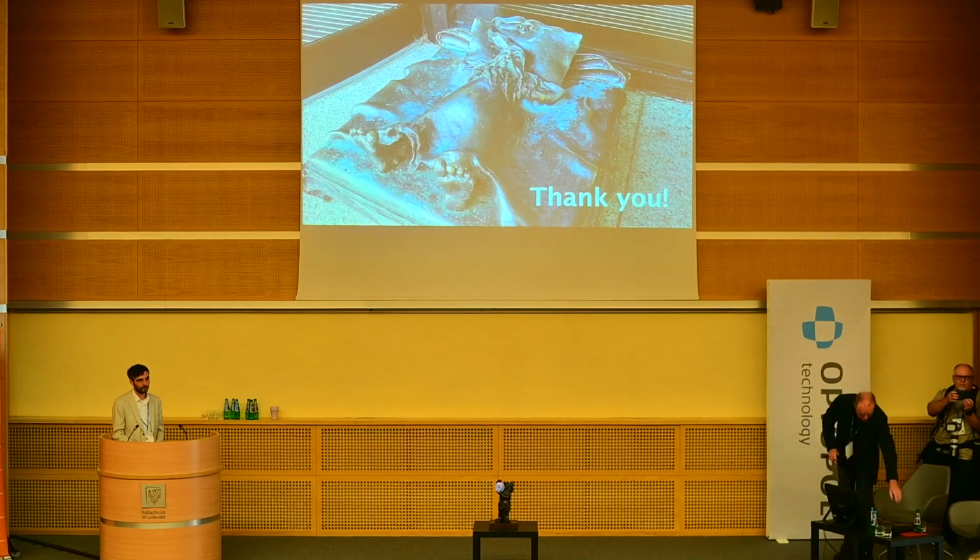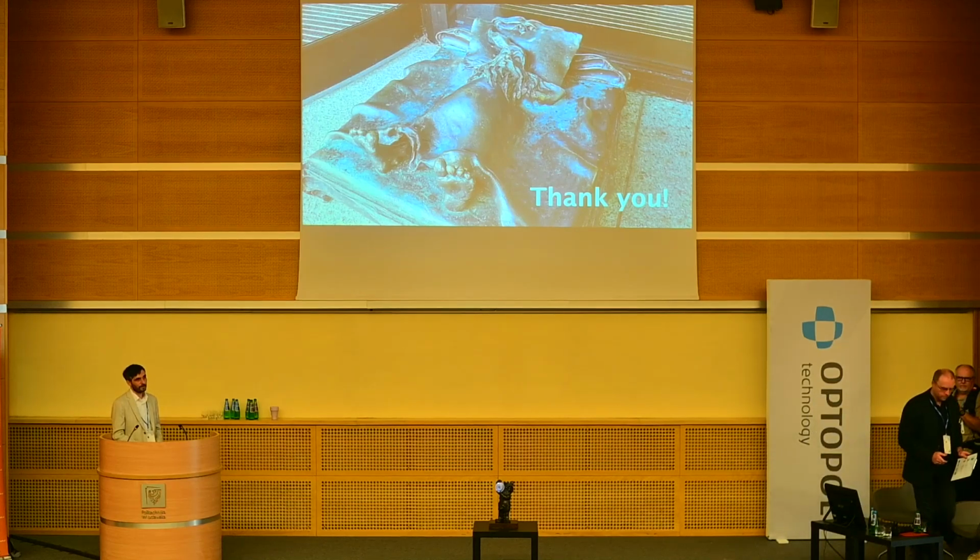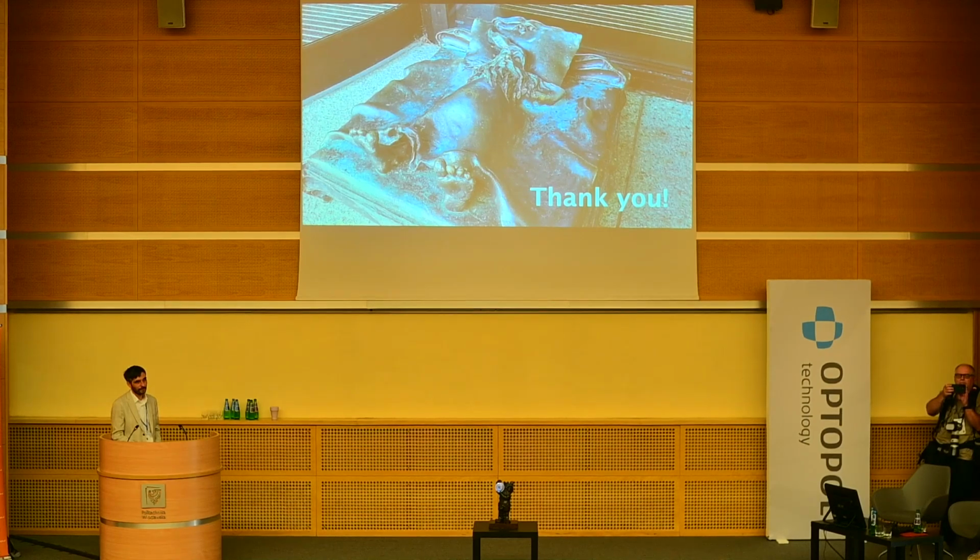And there's always a question when we look at this choroid data, is it real, or is it right at the limit of the axial resolution of these commercial OCT systems? So, as an expert, in your opinion, in the next 10 years, should we expect things to improve? Is there a hope that we'll be able to more accurately measure these small changes, or is the technology kind of mature for that, and what we have now is as good as it's going to be?